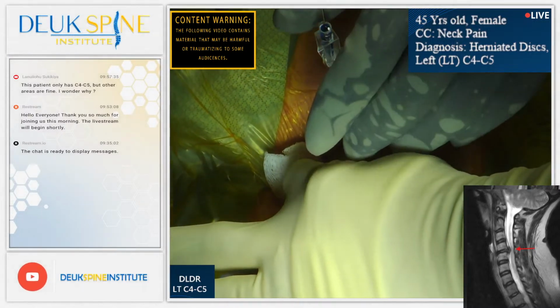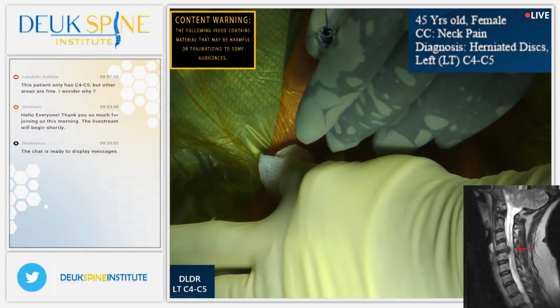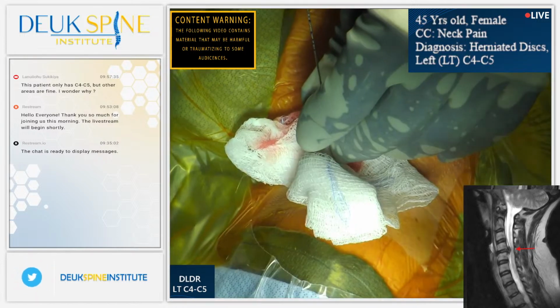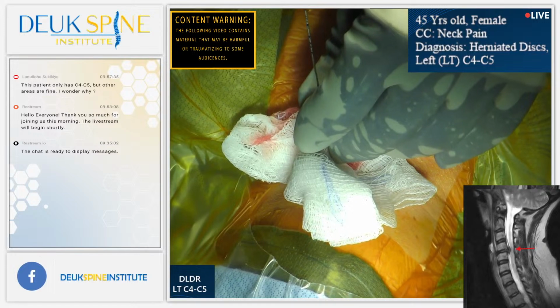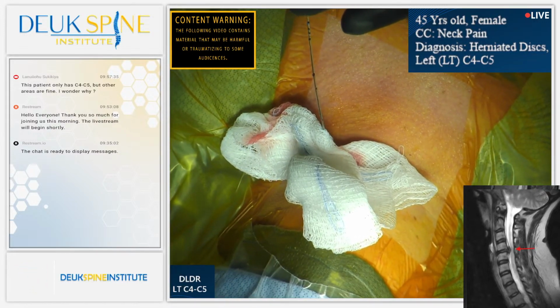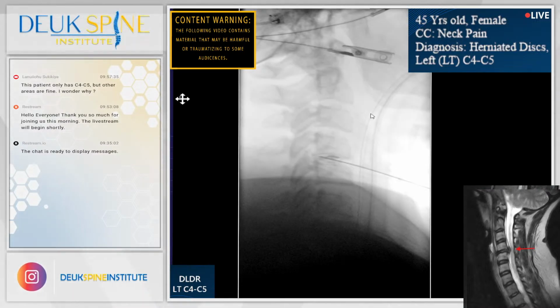We've placed the needle, we placed the guide wire. We're going to take the needle out and leave the guide wire. Jordan, show the audience the endotracheal tube on the lateral view, and there's the endotracheal tube. It's a solid line, and the esophageal temperature probe, which is in the esophagus, is a braided line. Okay, we made a 4mm incision.